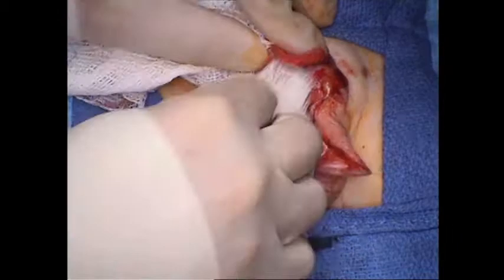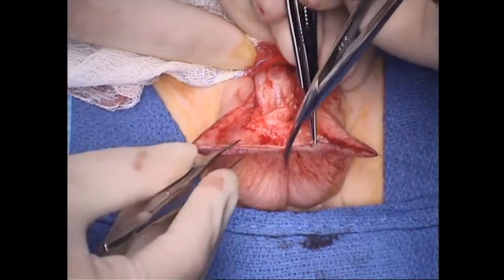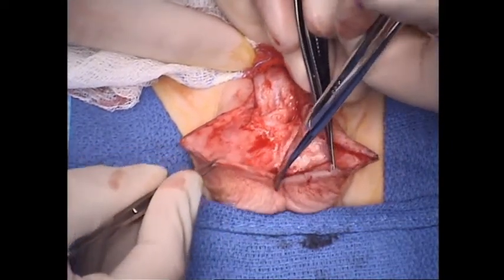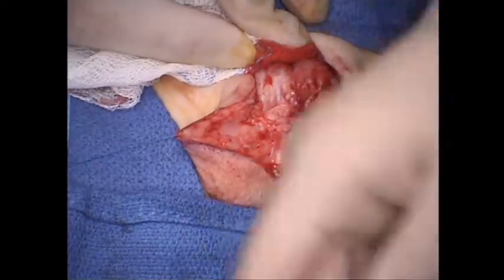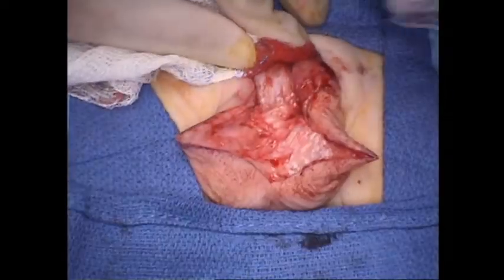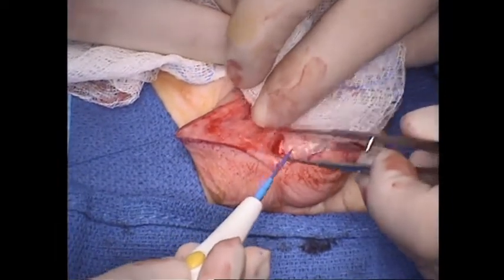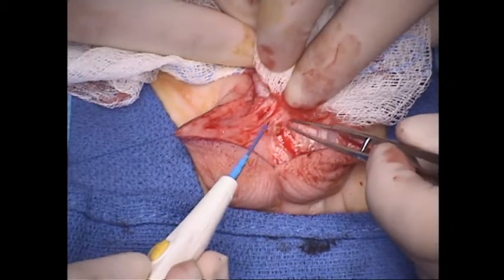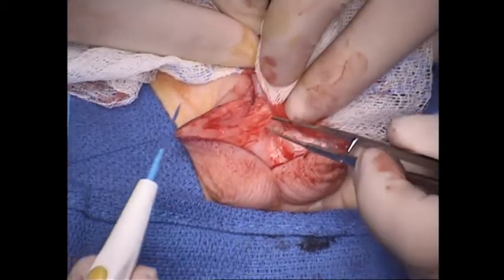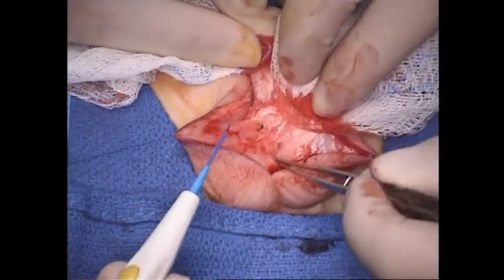There's different ways to achieve exposure too, but we have found this very simple system of just putting stay stitches, Prolene, into the open scrotum gives us ample view of what we will need to dissect in a moment. And as she said, the penis doesn't tend to bleed very much, but the scrotum has quite a few tiny little vessels in it, and we always have to spend a few minutes stopping those.